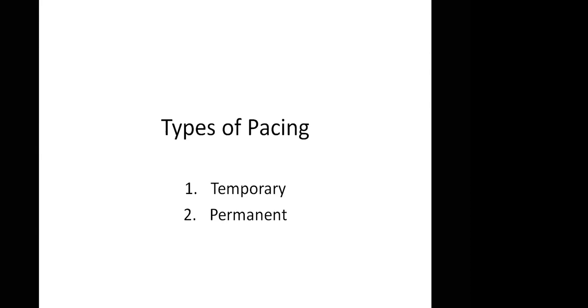Now, secondly, I want you to notice something. The first knob you are seeing is the rate. I'm sure you can see rate written on it. So that means you can determine the rate yourself. I want to place this patient at 80 beats. I want to place this patient at 90 beats. You can determine the rate yourself. Are we getting him, man? Dr. DM. Yes.